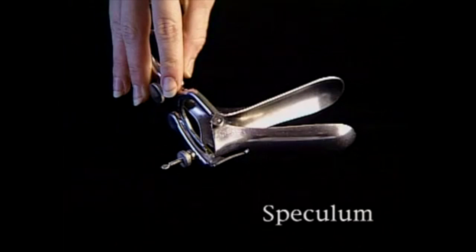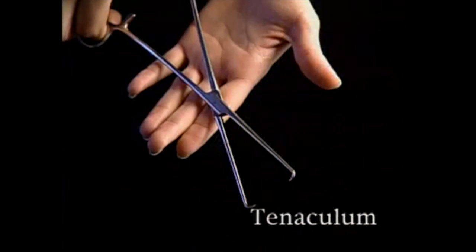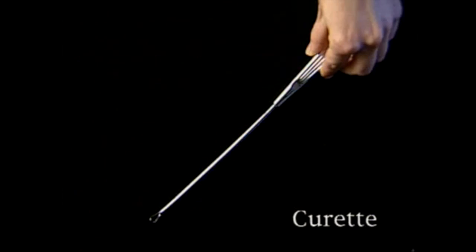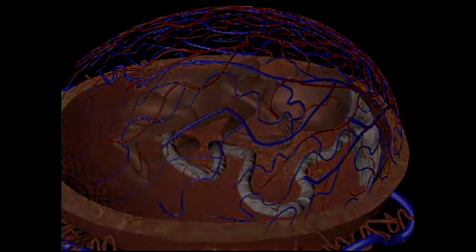For second and third trimester abortions, the most common procedure is dilation and evacuation, or D&E. Although the instruments used in a D&E are basically the same as those used in a suction curettage, the procedures differ in several important ways. First, because the fetus is considerably larger at this stage of pregnancy, a greater degree of cervical dilation is required. This dilation is accomplished in multiple steps, which means that most D&E abortions take more than 1 day to complete.